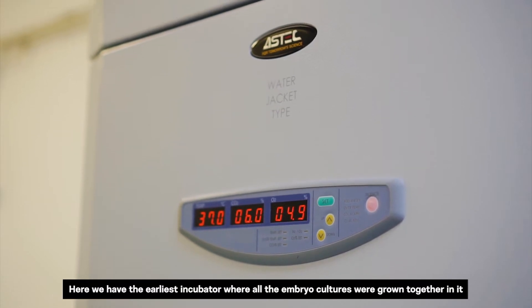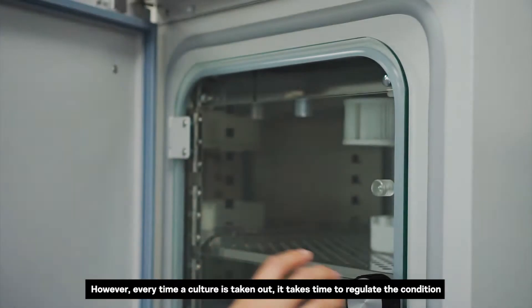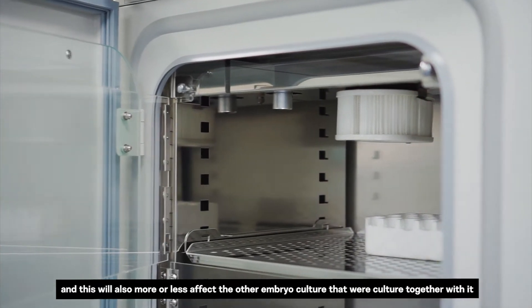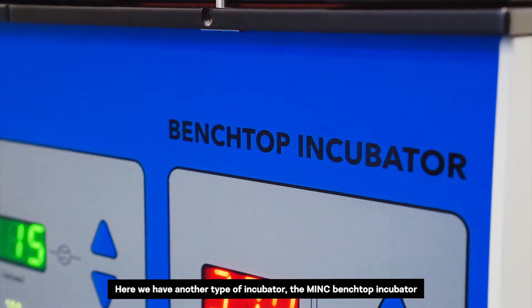Here we have the earliest incubator where all the embryo cultures were grown together in it. However, every time a culture is taken out, it takes time to regulate the condition, and this will also affect the other embryo cultures that were cultured together with it.